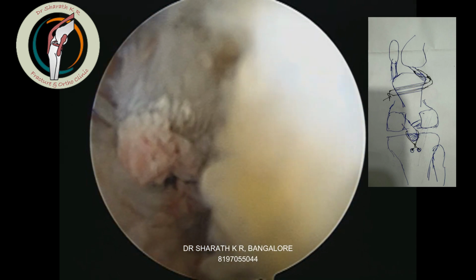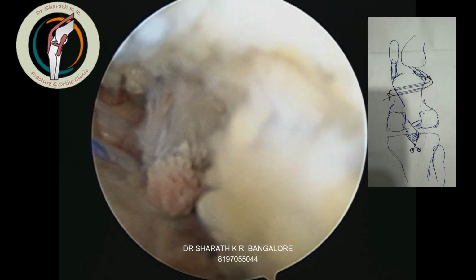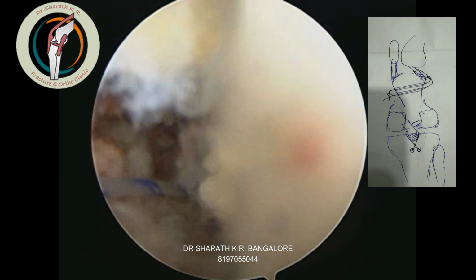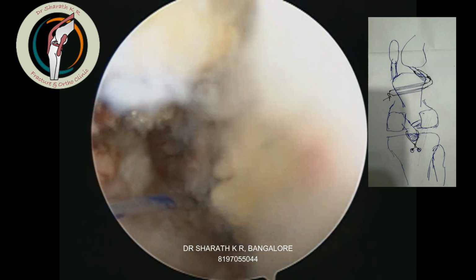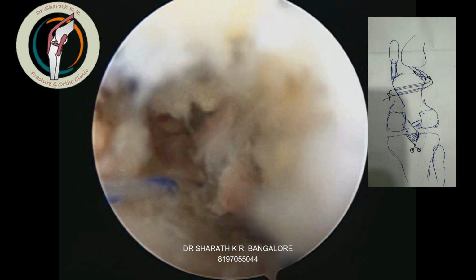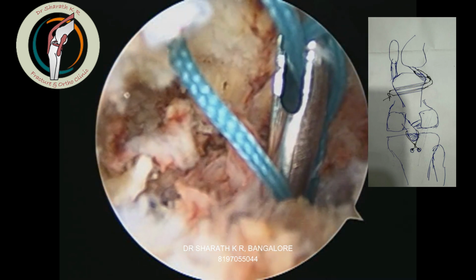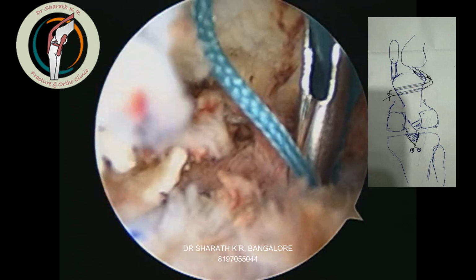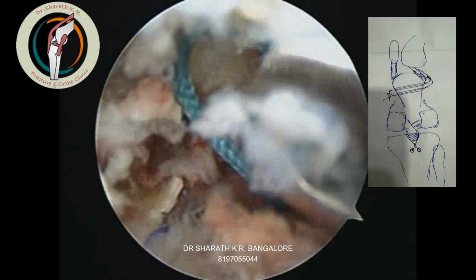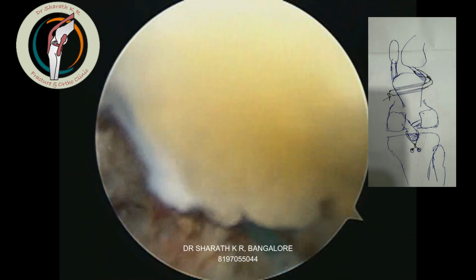You are now seeing the jig. We are creating another hole, that is a tunnel just medial to the PCL. Basically, we have to create the plane between the PCL and the posterior tibia, a little lower than what we normally do for PCL reconstruction, and then we can pass the threads using the shuttling of the Ethibond, how we are doing it now.